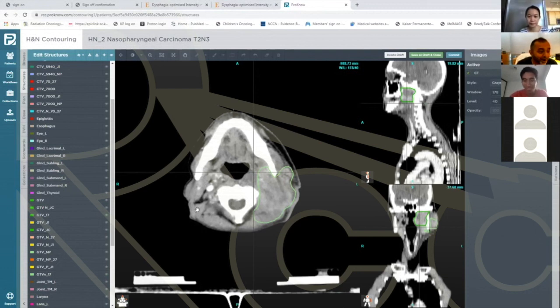The fatter you are, the better you can contour, because that subcutaneous fat is so helpful in discerning between tumor and normal anatomy. So when you have somebody who's so skinny, it's very challenging. But you can see this patient has no disease on the contralateral side.